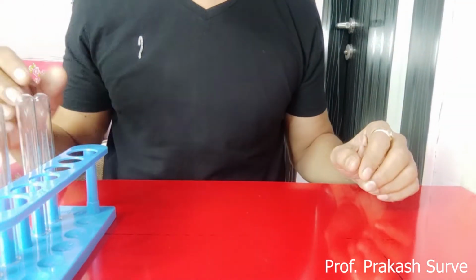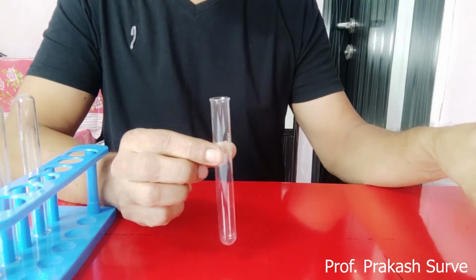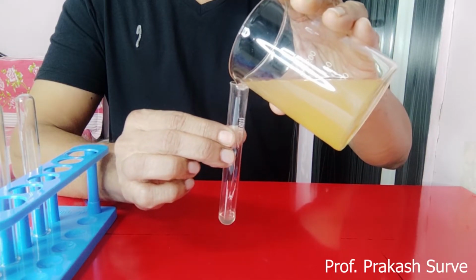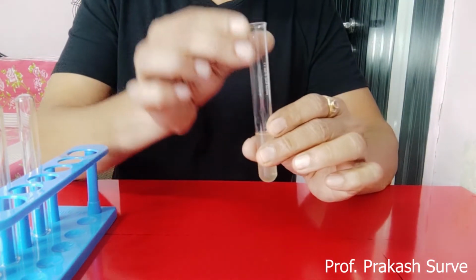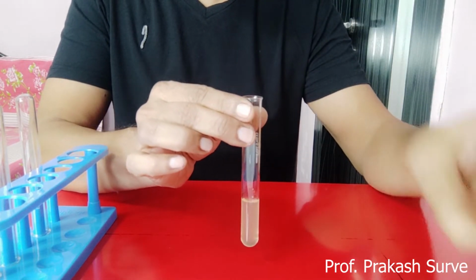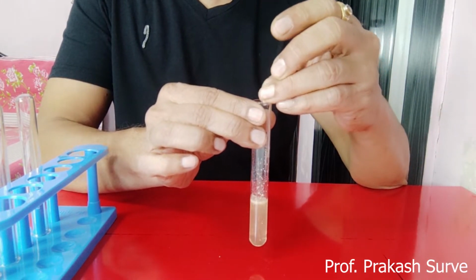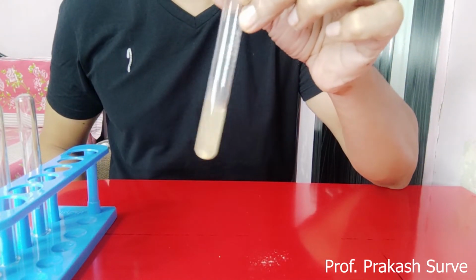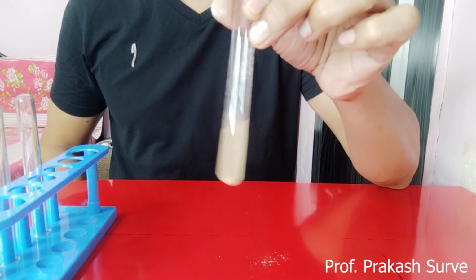Now we'll perform the test. First we'll take the test tube. In the test tube, approximately 2 ml of the urine sample. So here I will fill 1/4 of the test tube with the urine sample. In this we'll add a pinch of the soybean flour, and then shake it well. So what I have taken here is 2 ml of the urine sample plus a pinch of the soybean flour.